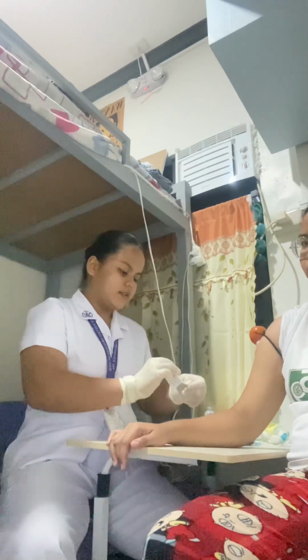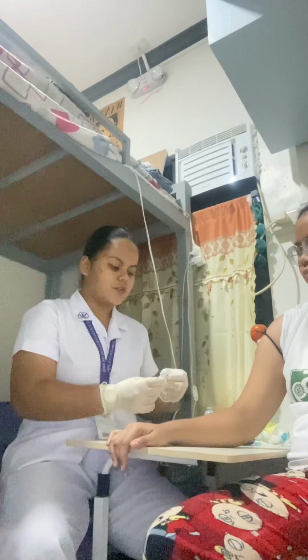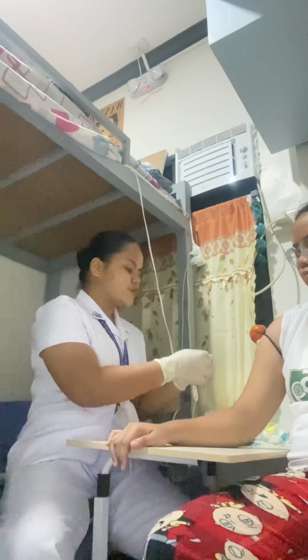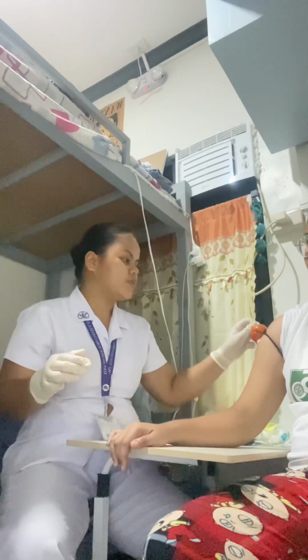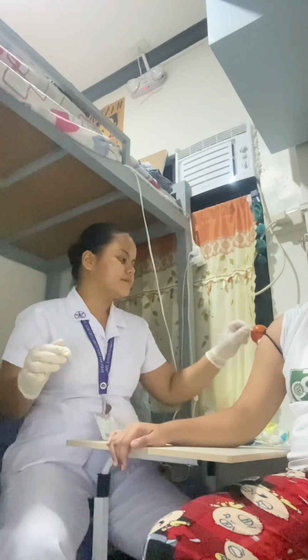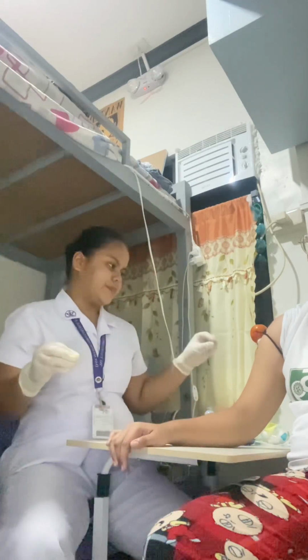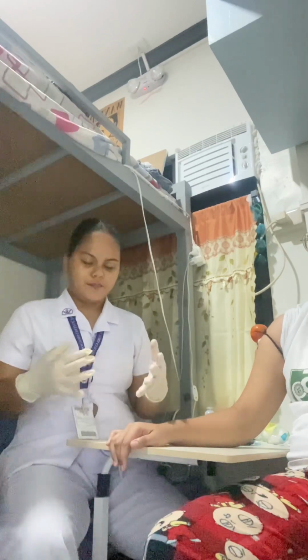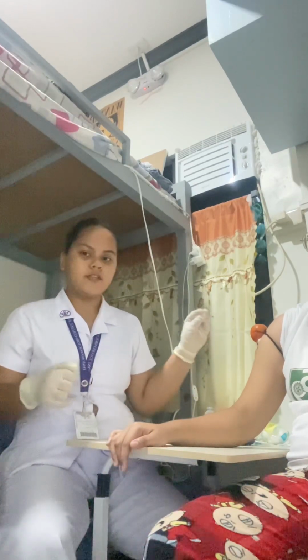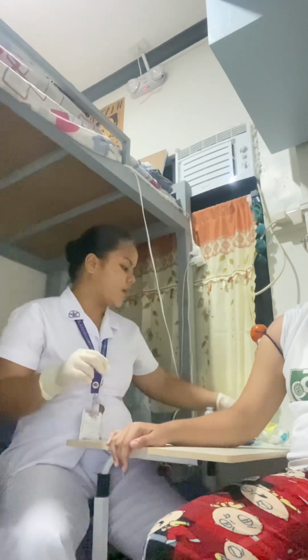In cleaning the site, we should do it in a circular motion, starting from a smaller circle into a bigger circle. The circle should be 2 inches wide. This will help to avoid exchanging of microorganisms. After that, I am going to allow the site to dry, and while allowing that to dry, I'm going to prepare my syringe.